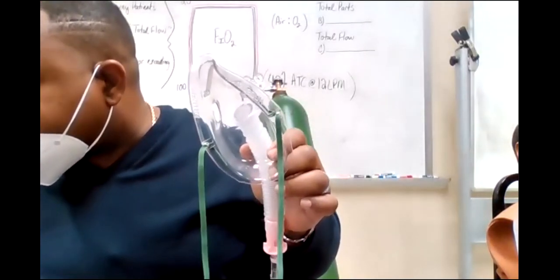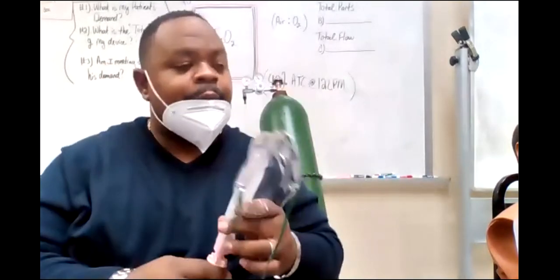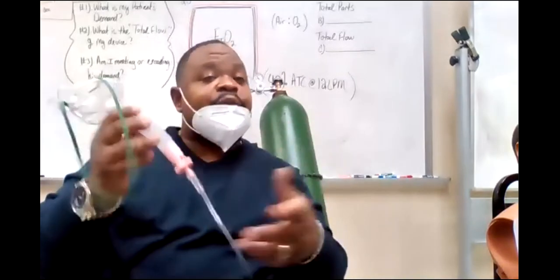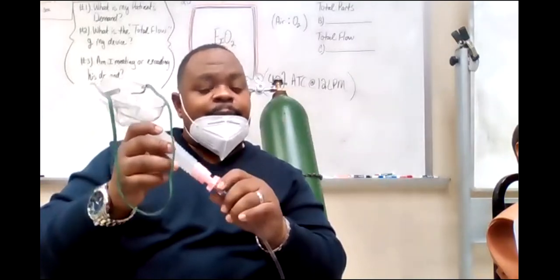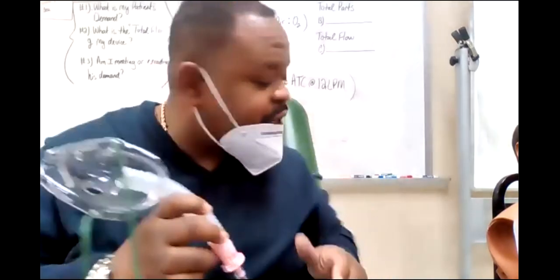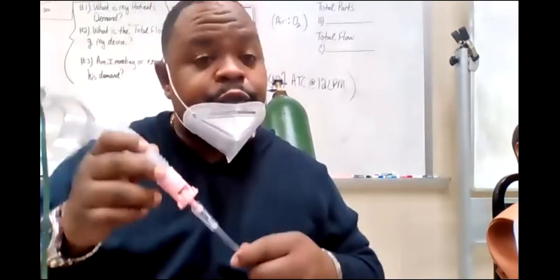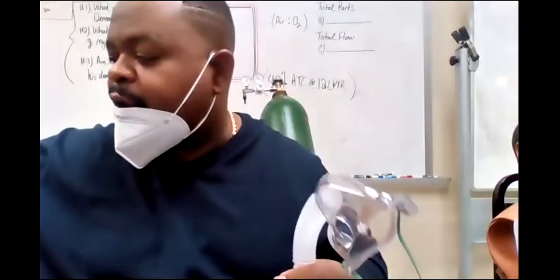Okay? It will guarantee the FiO2. Okay? That's the Venturi. Now, notice that they also have one that you can buy that's already put together. In the field, we like to use the ones that we do, okay? Now, I don't have the protection mechanism for this one, but there are protection mechanisms for Venturis that's very important, and I want you to be able to tell me why, okay?